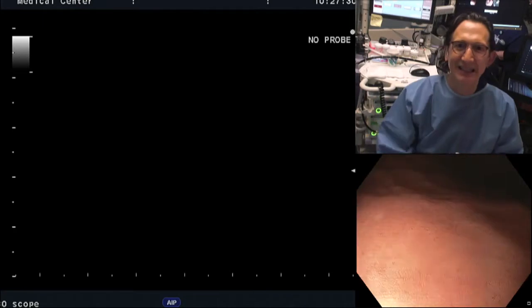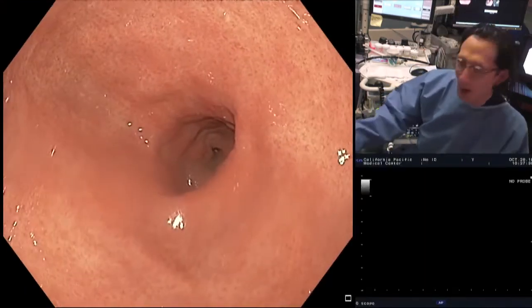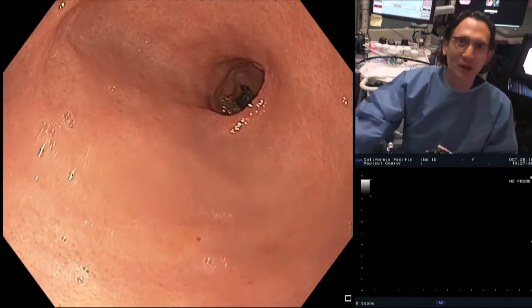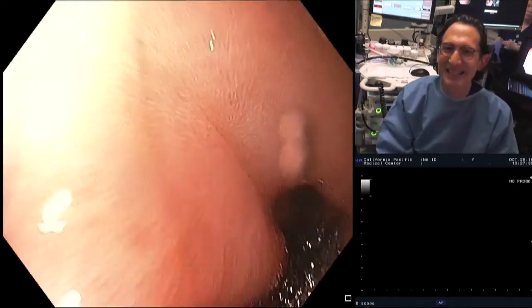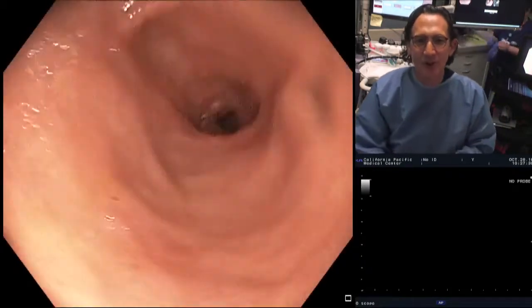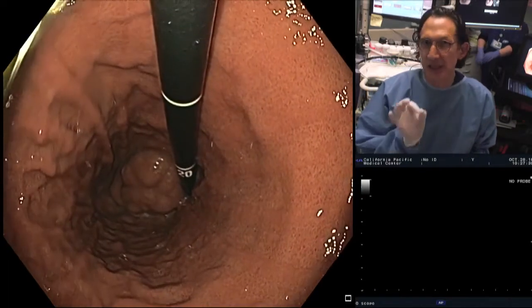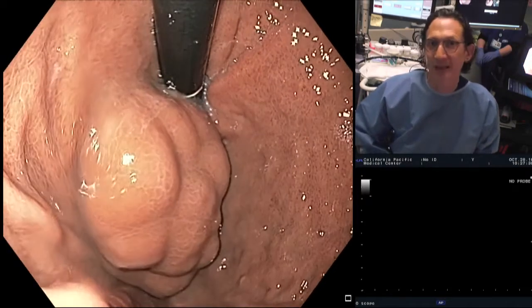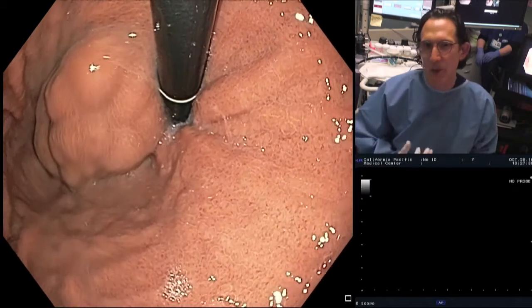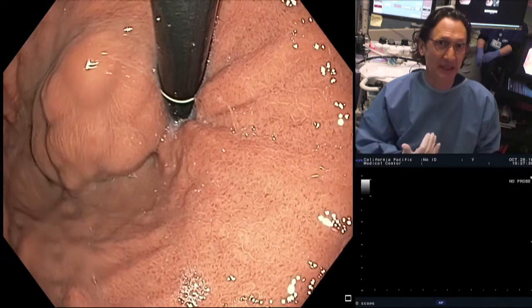So we don't see any other varices, no ectopic varices. Now, our star anesthesiologist is already starting to cringe. He's already opening up all his drawers for extra support here if the patient starts to bleed massively. What I can tell you, though, is that if you were to try to treat these with the conventional endoscopy-guided method, you may not complete your procedure because you would probably get a waterfall of blood spurting out after you puncture this from the stomach lumen.